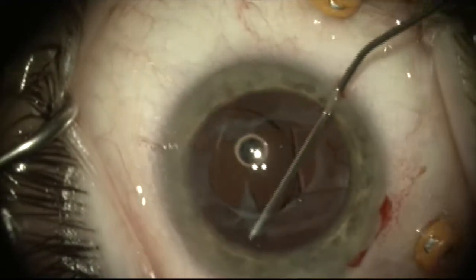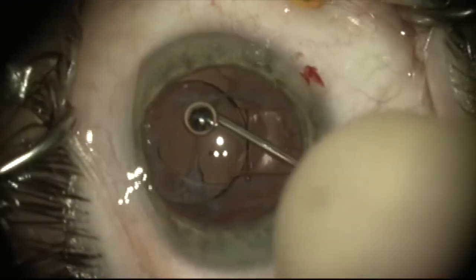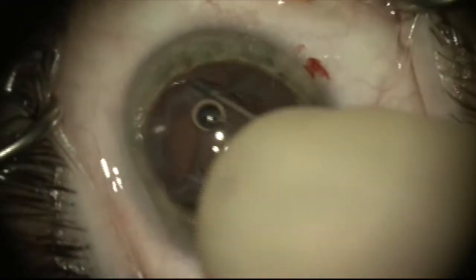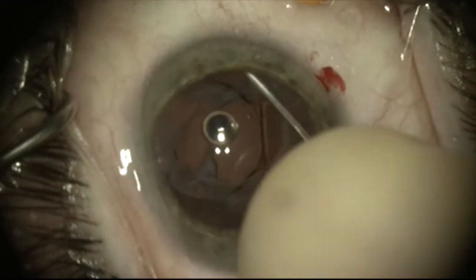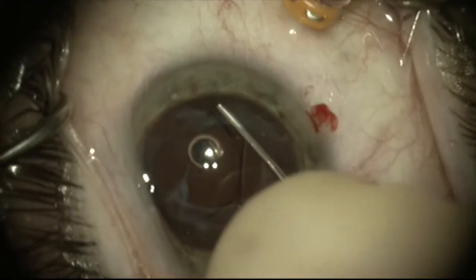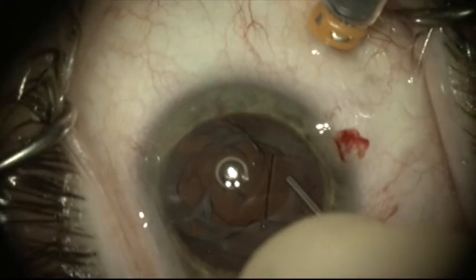But you can see that the lens is really pretty socked in. We're going to take some more viscoelastic from the other side and try to free up the lens a little bit, dissecting gently some of the fibrosis here between the anterior and posterior capsule.